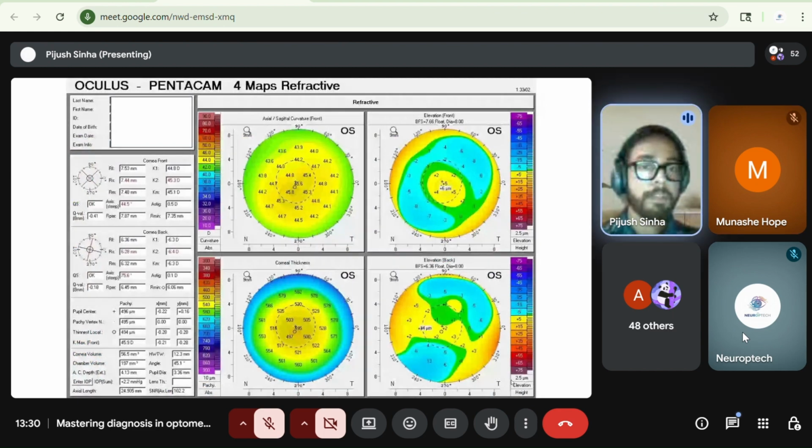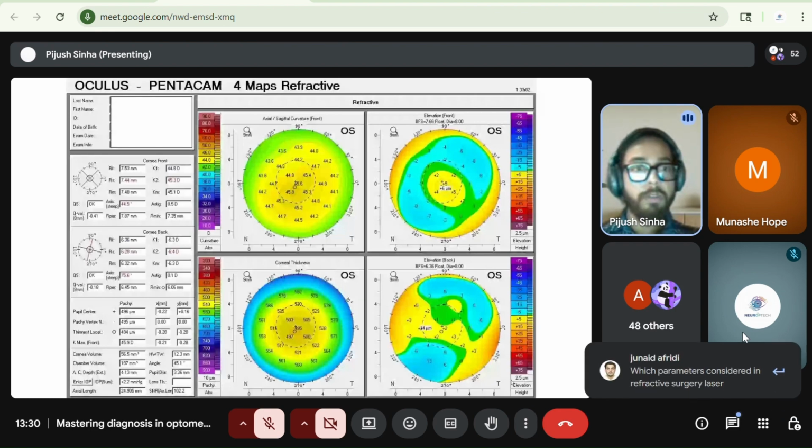Okay, so if someone is having myopia and come to us for orthokeratology, we do the scanning to know the corneal parameter. But if you are measuring it and found that the values are exceeding 47 and there is an ectatic condition, definitely orthokeratology will not be the option for that patient. And we need to go for the ectasia management. The values should be within the normal range, less than 47, and thickness should be normal, and there should not be very much corneal thinning. The overall parameter should be normal. It's not like there is a specific fixed value, but there should not be any ectasia, so that we can go for the orthokeratology.